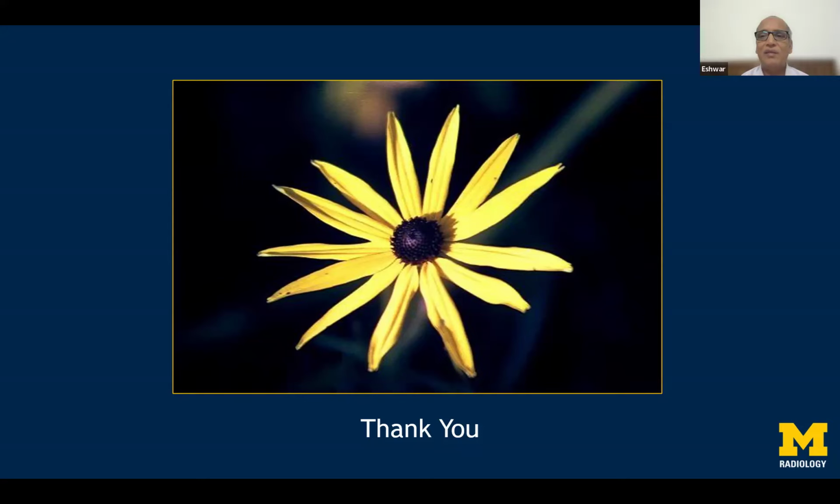Thank you, sir. Is there any report template or a checklist, a standardized thing which is there for reporting on CT for sinus disease? Yes, I'll share it with you on Monday. When I'm on clinical service, there is a template which we use for maxillofacial CTs, and it's a pretty comprehensive template. You can't miss it. So that, we tick on each of these things.